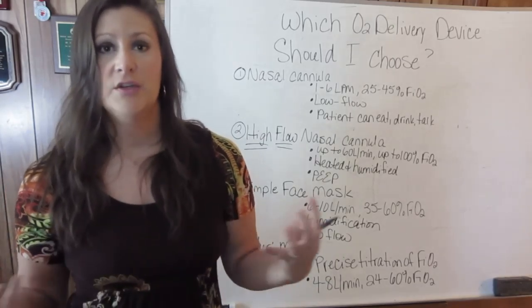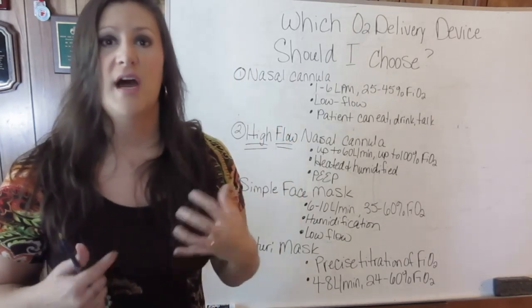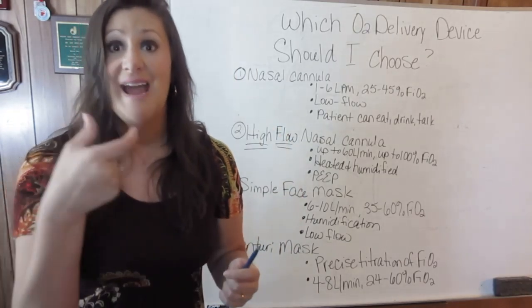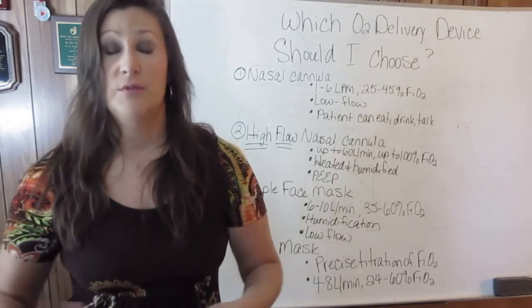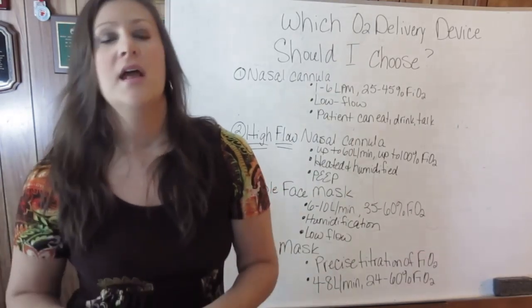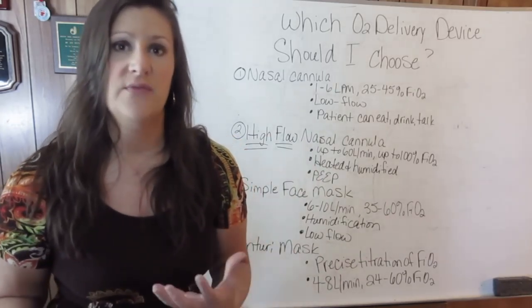Now, where I do clinical, where I work, the different levels of FiO2 that you can attach to your Venturi mask are different colors. So let's say, and I'm just making this up off the top of my head, let's say that I want my patient to get 45% FiO2.